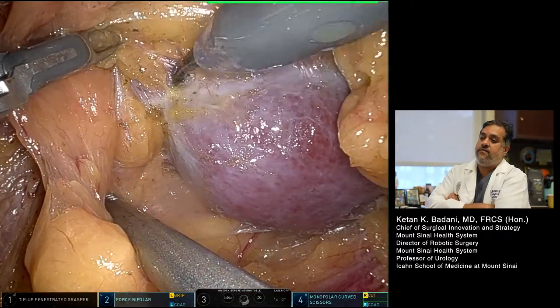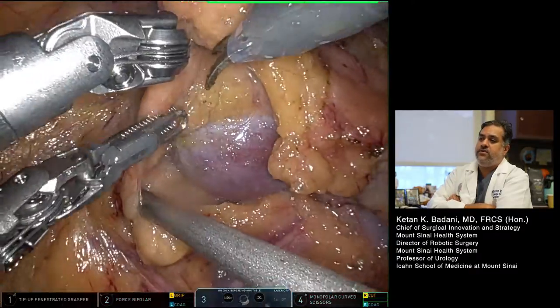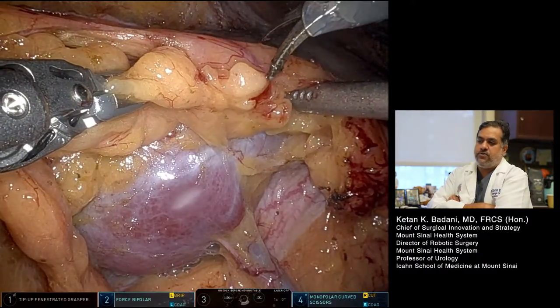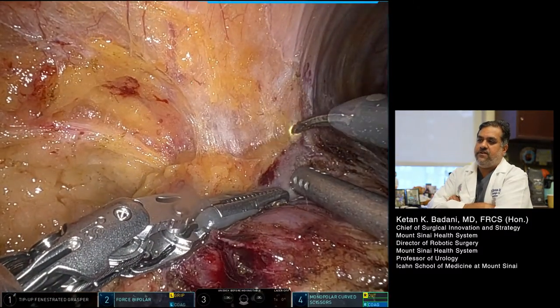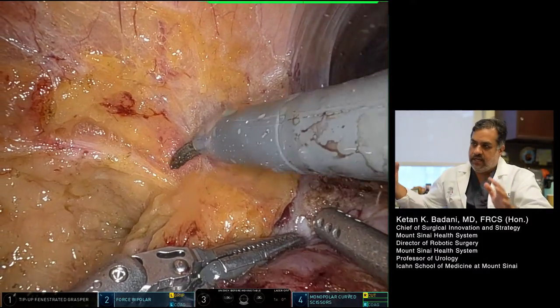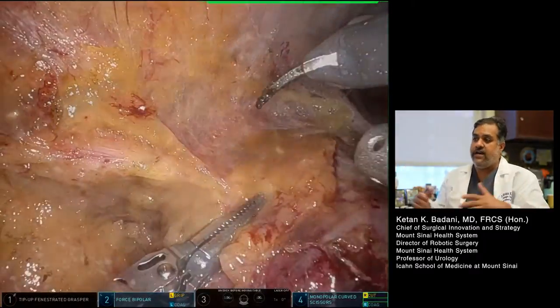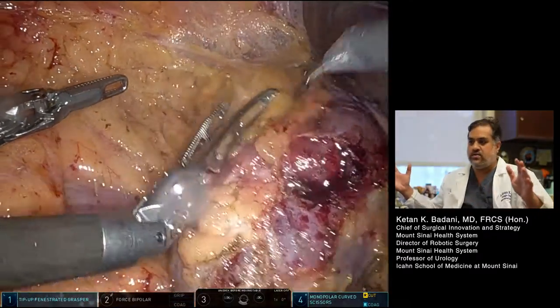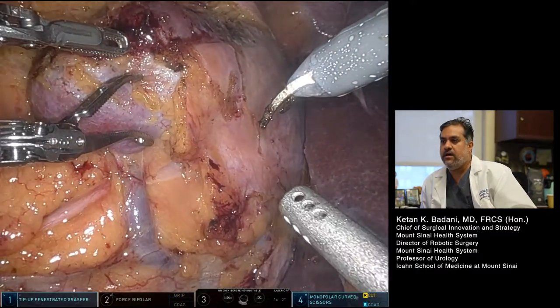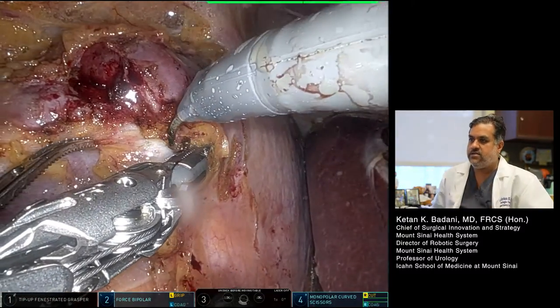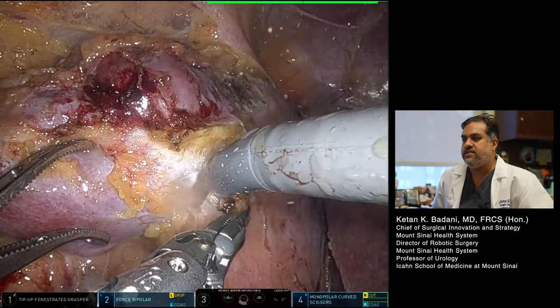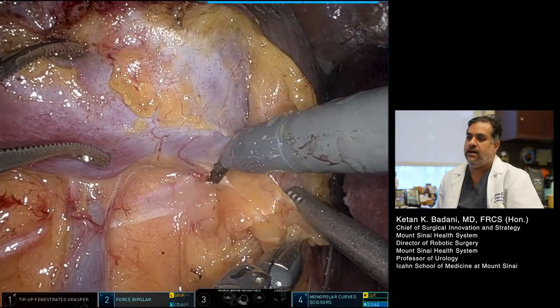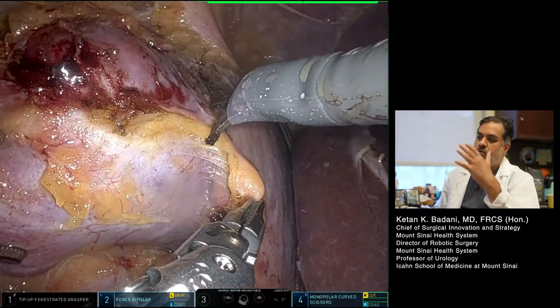Next step is exposure of the renal mass. It's a fully endophytic tumor so we may not see it from the outside, but we know generally where it's going to be. It is my practice and belief that you need to widely expose the capsular surface of the kidney. One of the things that makes a partial nephrectomy difficult is if you don't have wide exposure — you may have to dissect more fat during clamp time to get your angles, and you really don't want to do that. Take your time and really expose the kidney, especially in these endophytic tumors.